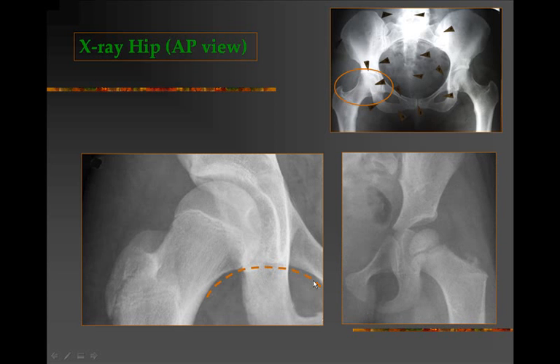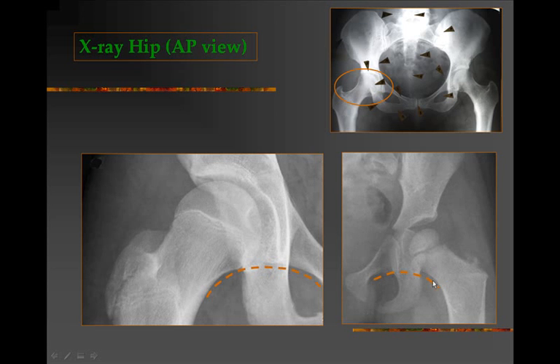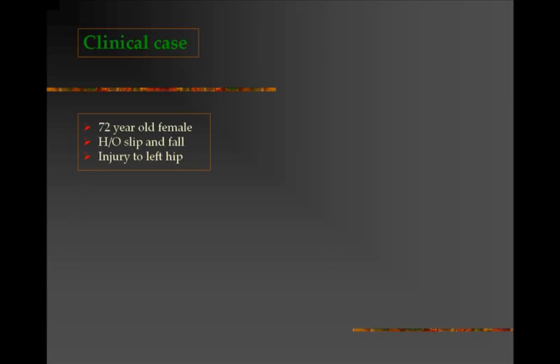A similar x-ray of the left side in a young child shows unfused or open epiphyseal plates on the femoral head and neck region and also in the acetabulum. The continuous line extending from the inferior border of the superior pubic ramus to the inferior part of the neck of the femur is also seen in this example.